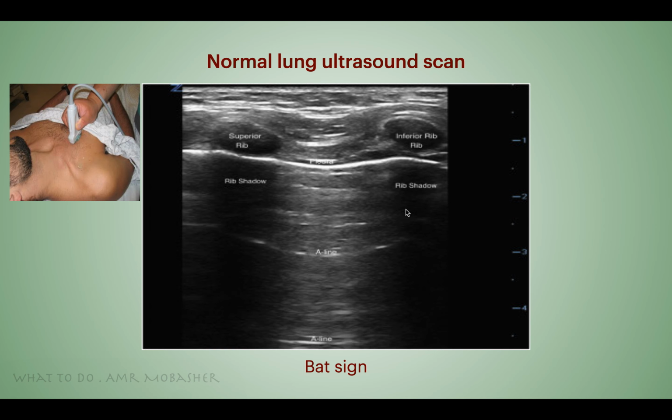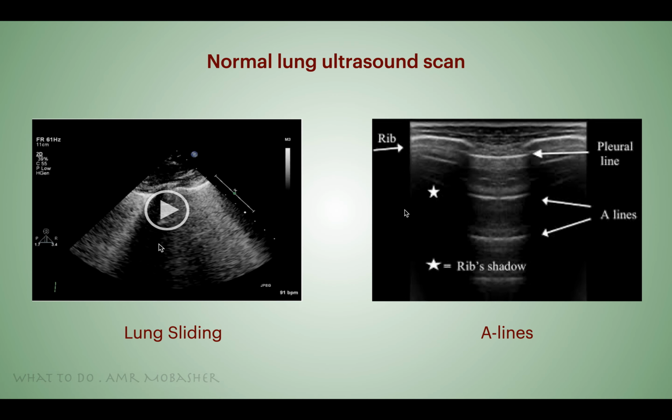This is the beginning. Sometimes, because the pleural line is a very reflective, very bright, very hyperechoic structure, it might have some reverberation artifacts or mirroring like this, which we can find at similar distances between the probe and the pleura, again and again and again.